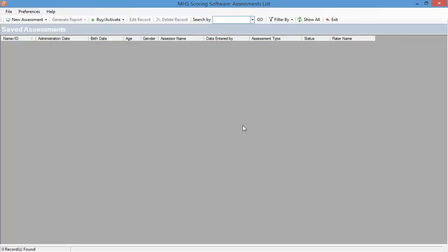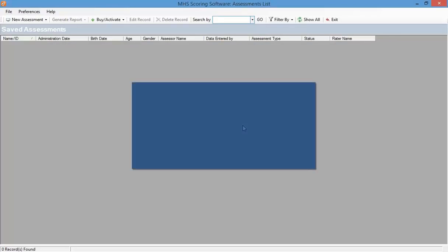To prepare to administer the Connors CPT-3, you insert the Connors CPT-3 software key into the test computer and access the program by clicking on the MHS scoring software icon.